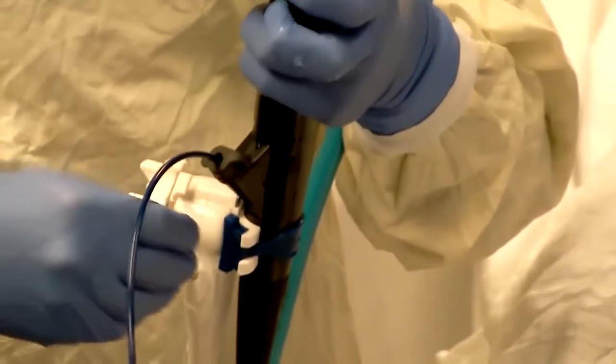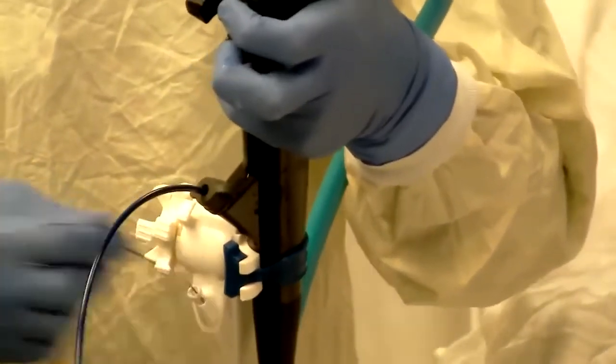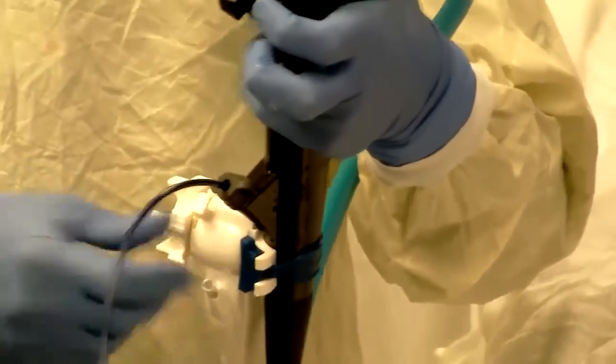One of the challenges always in single operator cholangioscopy is passage of these instruments through the single operator cholangioscope when it exits the duodenoscope. You'll always find that these accessories get hung up in two locations. They get hung up as they exit the working channel. So I'm now advancing it gently. The second time that we have a problem is at the tip of the single operator cholangioscope. At both locations, there is generally a problem in exiting. Right now, I have zero problems advancing it down gently.